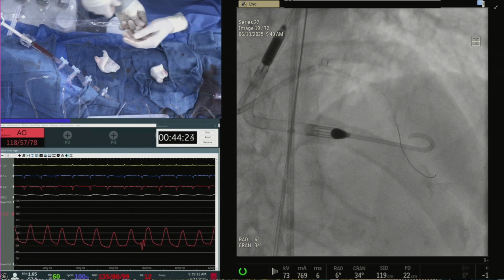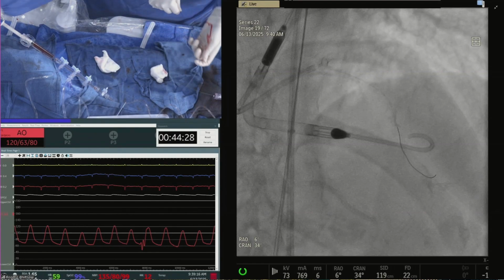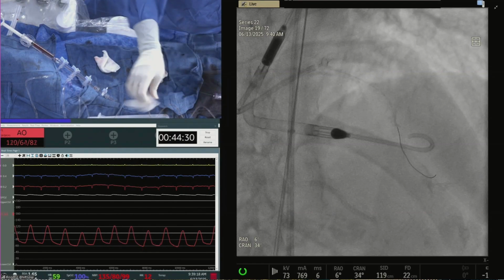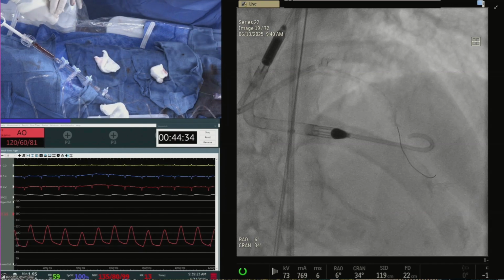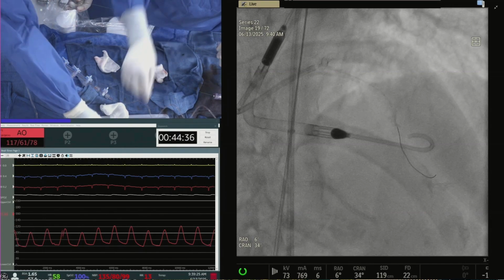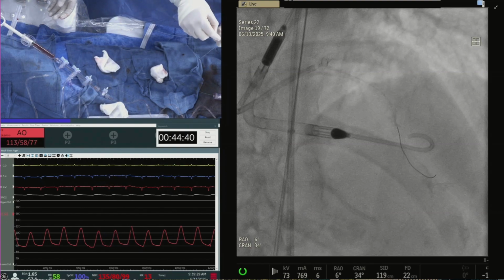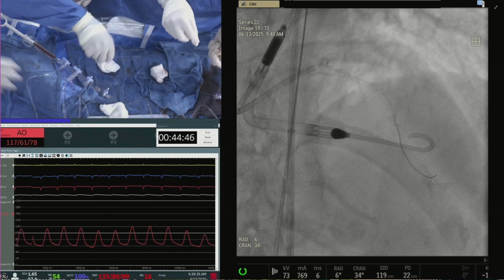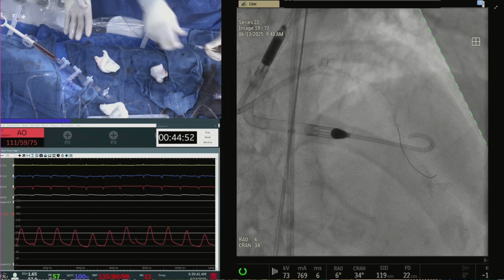Okay. We're going to try wiring the diagonal for a little while, then you can go to the other side. Either a Supercross or a Recross catheter or a Suzuki, you put it down there and then put it in the side branch. Those actually are amazing to wire because you have support right there. So I would either put a Suzuki, Recross or a Supercross. Those things actually don't need too much lumen. So if I take one of those dual lumen catheters and put it next to the tank, I think the Fielder will go in the LAD. So that might be the way to go.